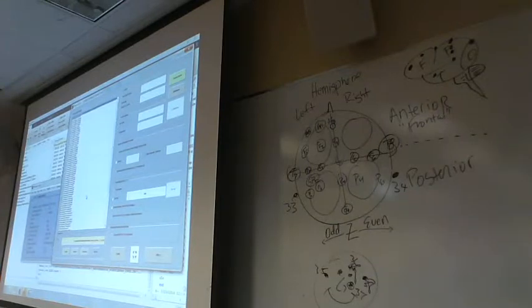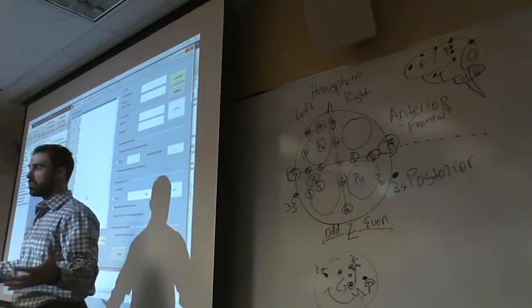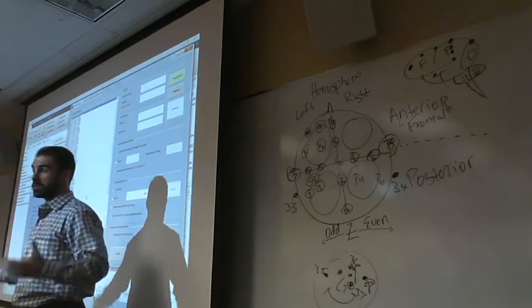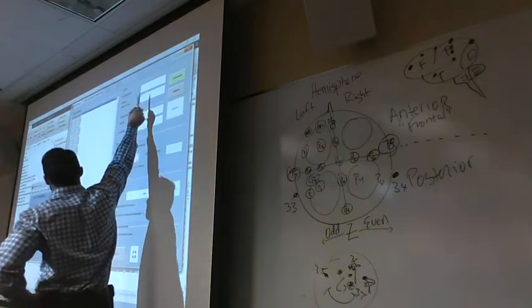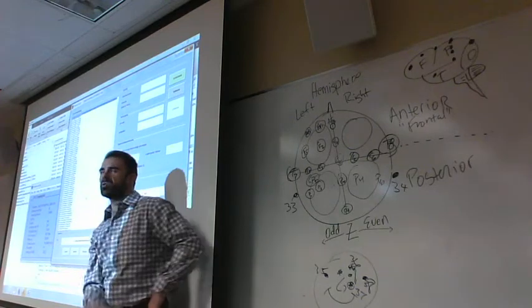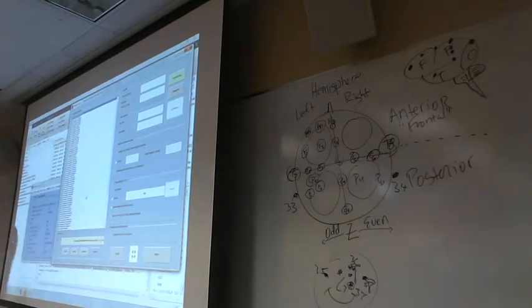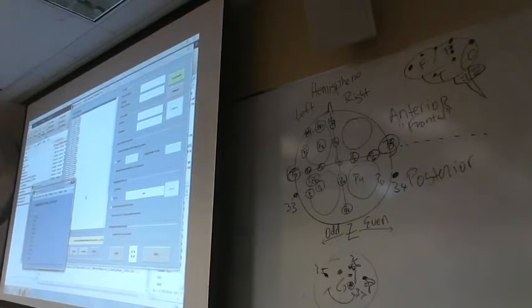Now, first of all, if you needed to go to a job and start just building this and typing it, somebody asked me at the end of the last class, are you going to show us how to build this and type this? So here's the answer, yes. Okay? You're going to start with your event code and type in 6111. Then it's going to ask you to give an event label. Now 61, I think, is animacy condition. So this is our code, and it's going to ask us for a label.